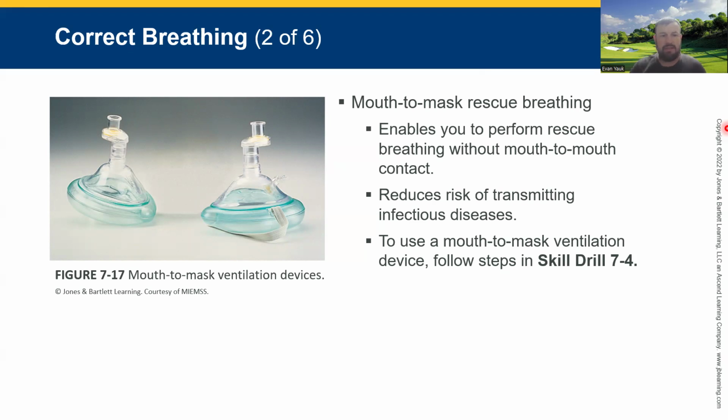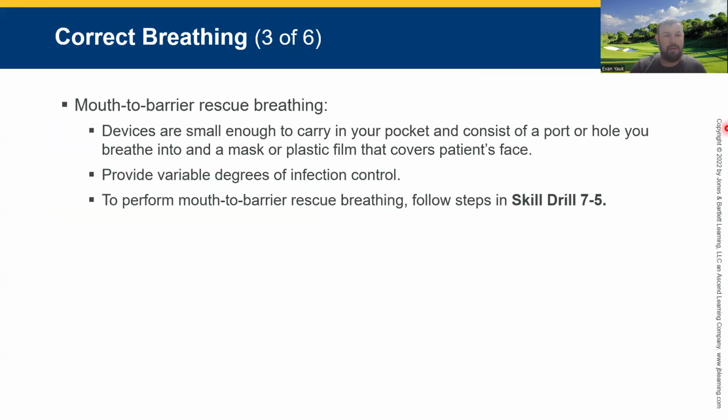What's cool about these is it has a one-way valve, so air can go in, but nothing can come out. And when I say nothing, I mean their nasty breath. I mean their vomit. Anything that comes out of them can't get to you because of that one-way valve.